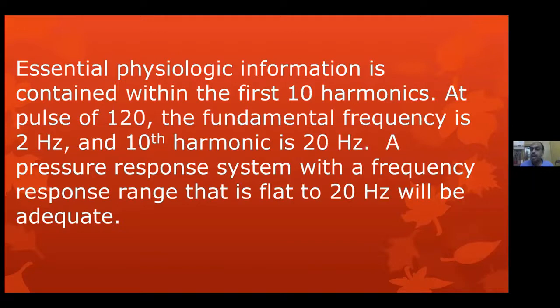Another question: among echo and cath pressures, echo will have a higher value. Which of these values should be the criteria to refer to surgery? Echo is the gold standard. The referral for surgery for an adult calcific aortic stenosis is based on echocardiography only.